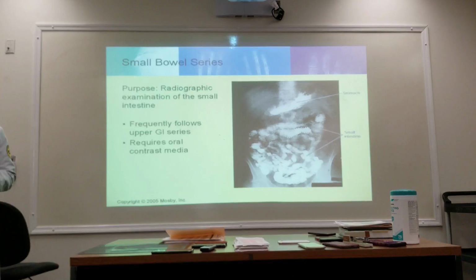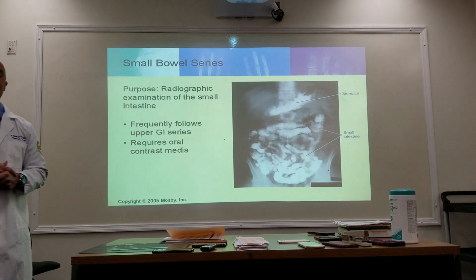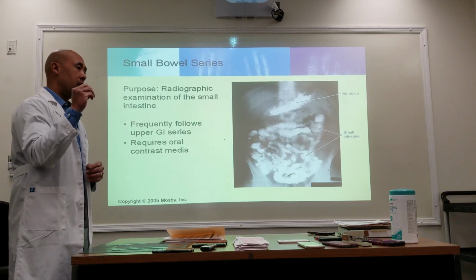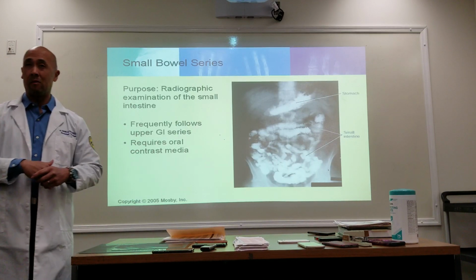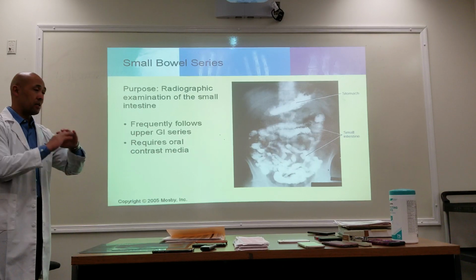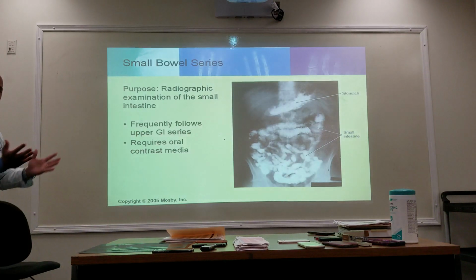Another one would be, it's not so much of a contraindication, but before you perform a study like this, again, you want to double check and make sure that the other departments are not performing some type of procedure in which the barium will get in the way of their study.